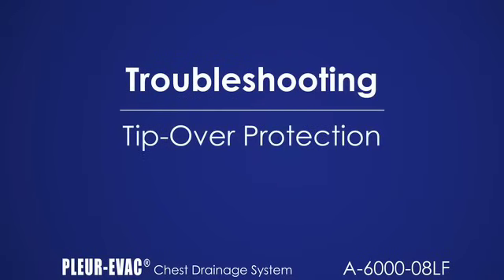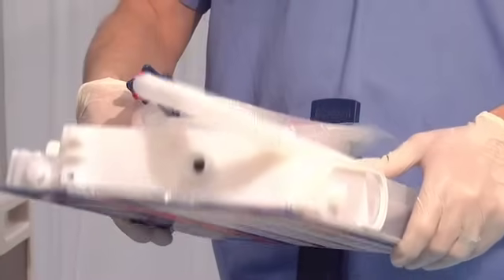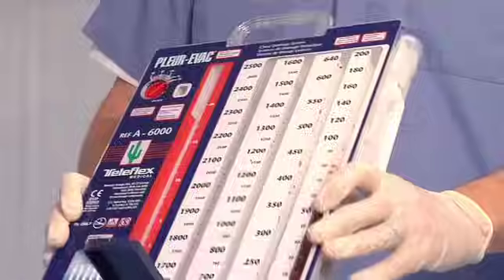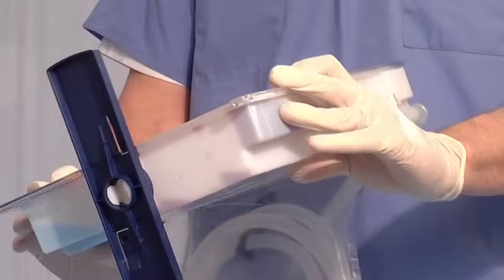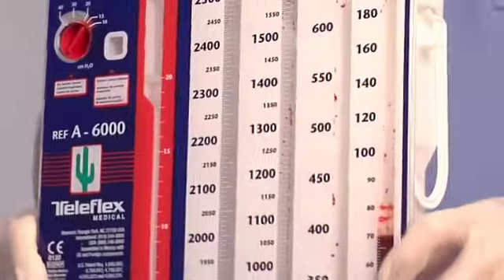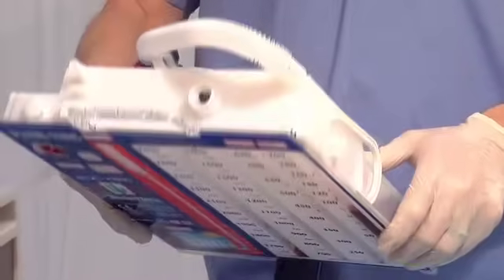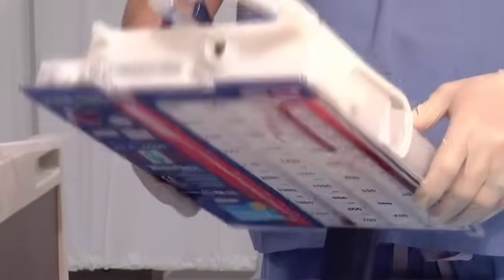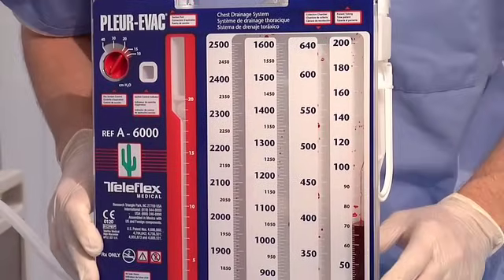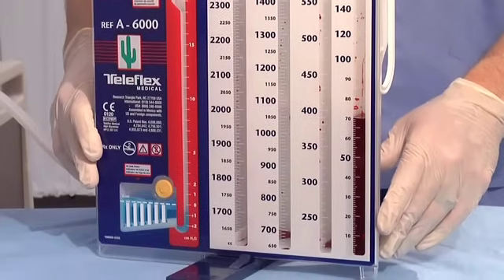The A6000 has built-in protection to protect the fluid from exiting the water seal during clinical use when tipped over. Do not turn the product upside down. While fluid remains in the seal when tipped over, in the absence of suction with this technology, the seal can be broken. Note, fluid can cascade among the four sections of the collection chamber. To restore the unit upright, note patient and fluid levels and either replace the unit or continue use in accordance with hospital policy.